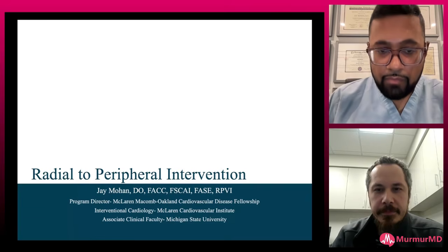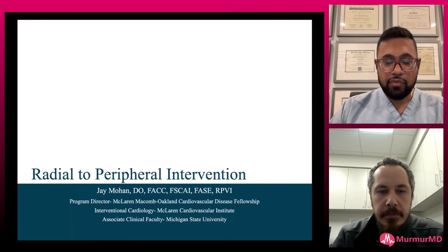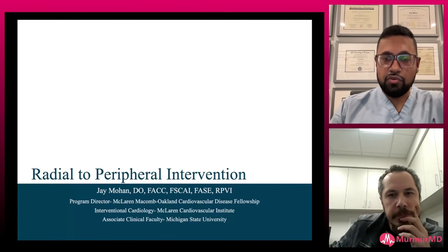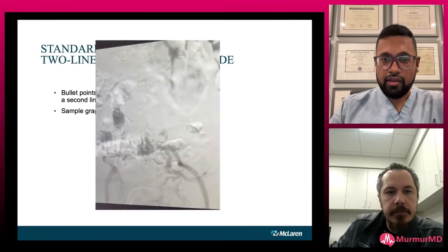Thanks, Sam. Actually, I have two cases here. Interestingly, one was from when I first started as an attending in 2020, and then I had one just recently in October. I put them both together because I thought it was very interesting how similar they were. These are the cases you will probably see as a practicing interventionalist when you encounter iliac CTOs. They always seem similar, with a lot of similar aspects, so I thought I would highlight that.